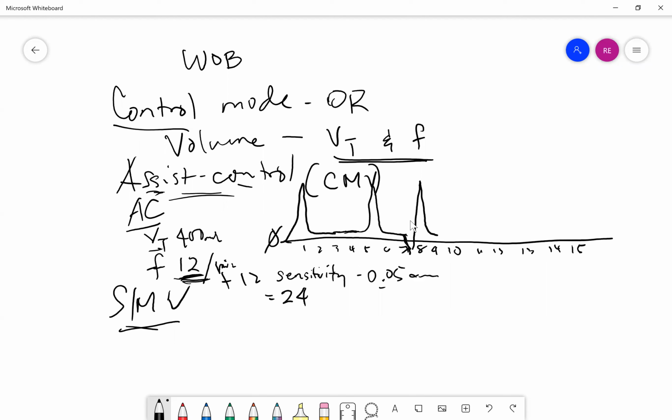That's already hyperventilation. So one problem here is the patient could potentially go into respiratory alkalosis. As the patient gets better, you will see it based on the ABG. During the course of your ABG checks, you'll start seeing a pattern of respiratory alkalosis over several hours.